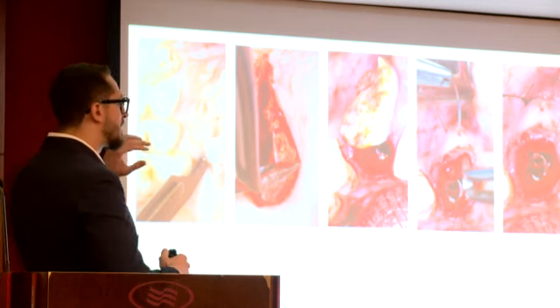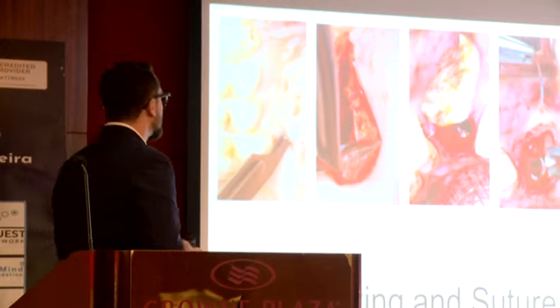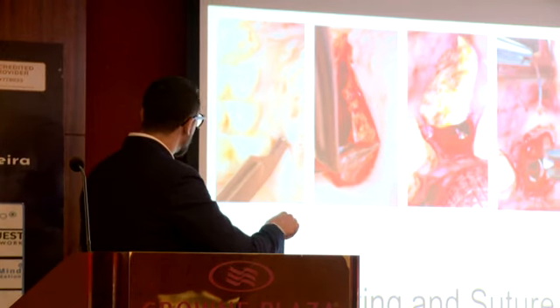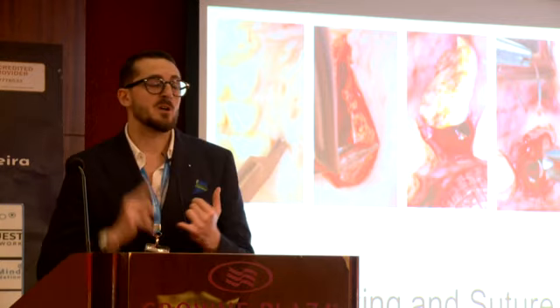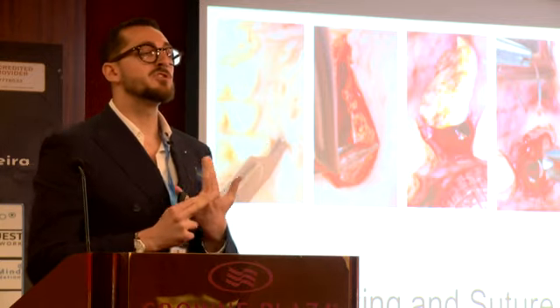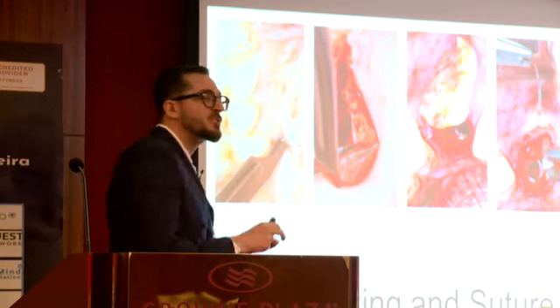So since you have your tunnel done, you can go to the palate, in this case, and apply a single incision technique. You can see here the single incision, but you can also use a trapdoor technique and also a free gingival graft technique. Nowadays, basically I always do a free gingival graft technique.